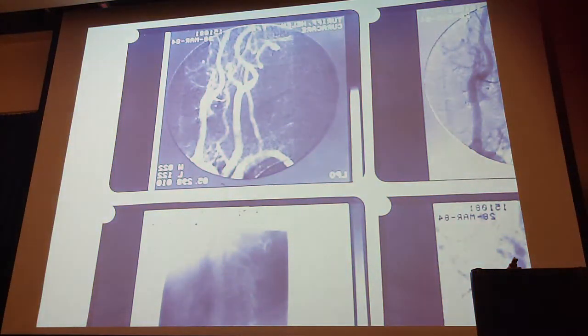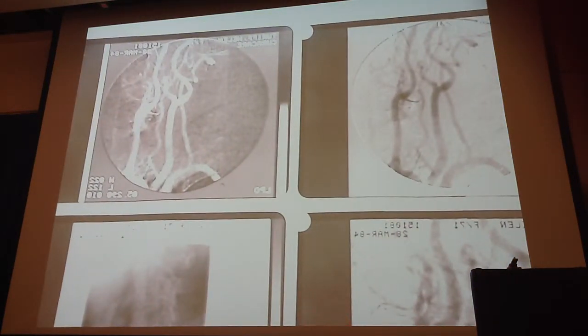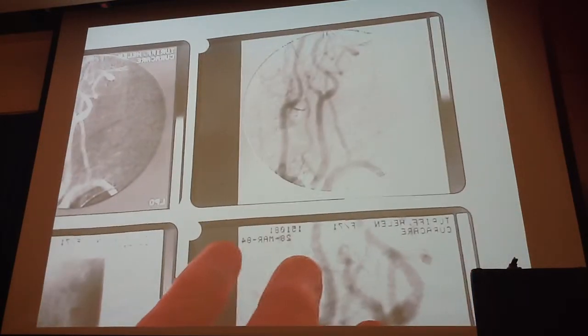Just to give you an idea about grainy images. Everyone recognize that? It's a carotid angiogram.